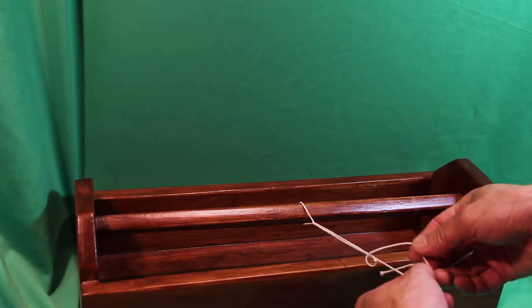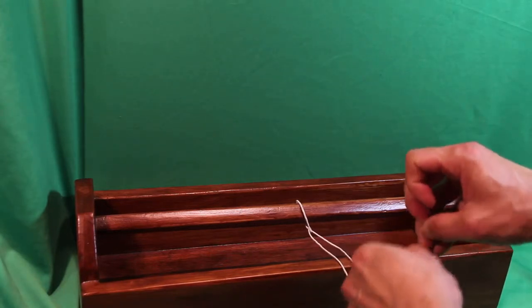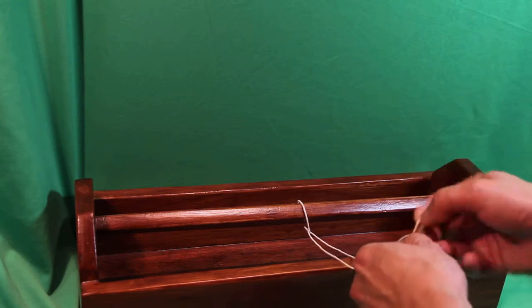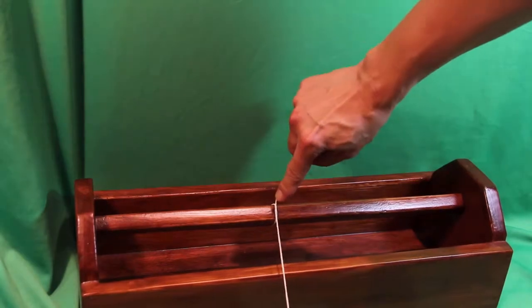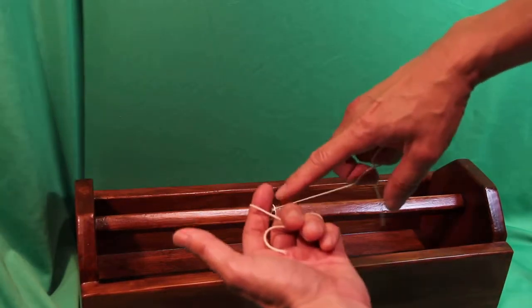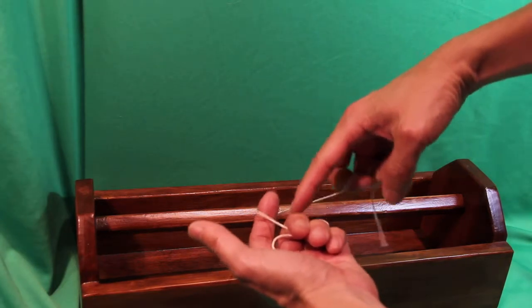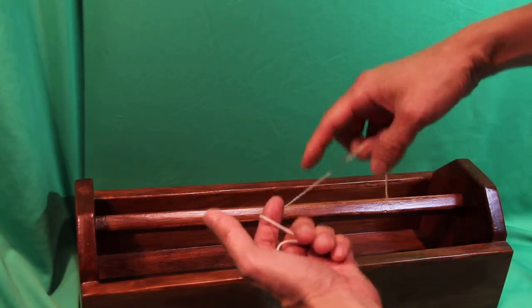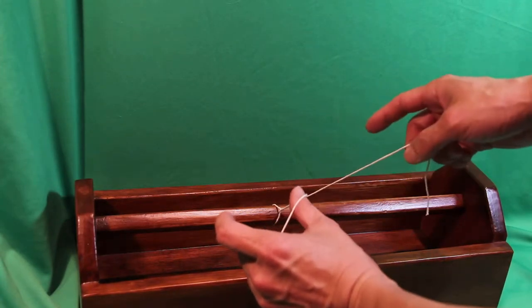Second throw. Okay, now you got this throw flat. What you want to do, again, stabilize this end of this suture to these three digits or two digits. Use your thumb this time, not your index, but your thumb as your anchor point.